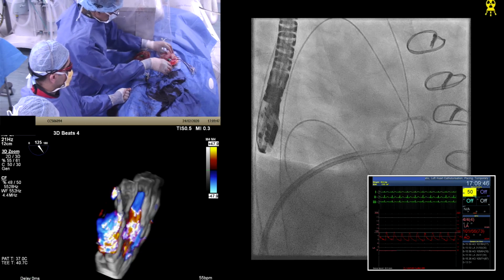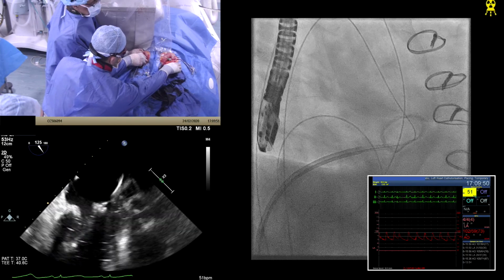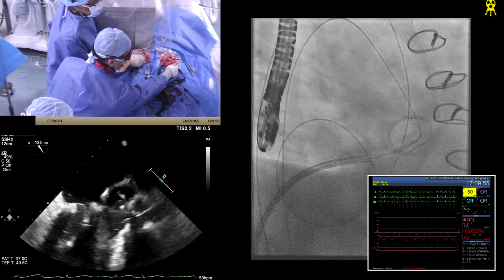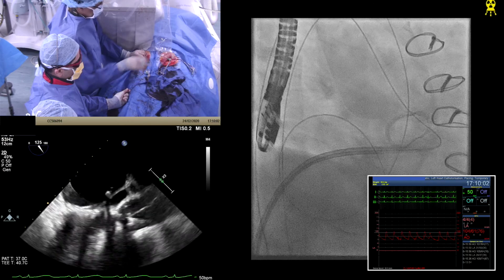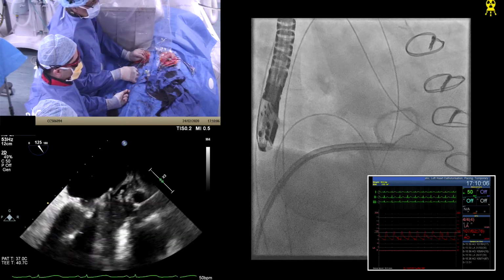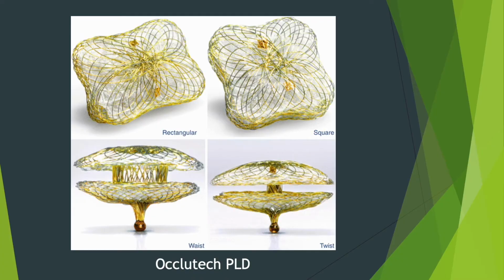Wow. So I'd like to really push. Shall I press both? Shall I pull both? I think pulling is probably not needed, because I want it to actually prolapse down into the ventricle. Okay. So I'm going to try and deliberately push it into the ventricle. There we go. Okay, because I don't want it to go across the aortic valve. So that's across. So what I want to demonstrate is the device.